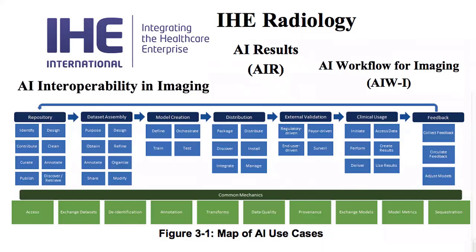But we also need the current IT, PACS admins, and business administrators to understand the data distribution, sensitivities, scaling, timing, tracking variations, bias, and population issues. We need the interoperability and semantics profiled in Integrating the Healthcare Enterprise.